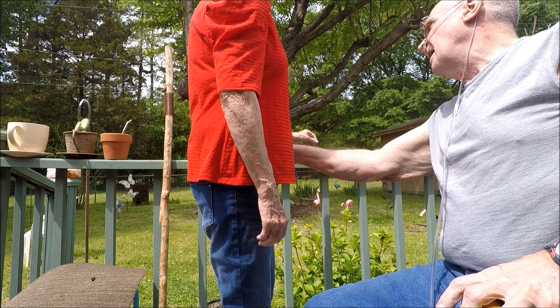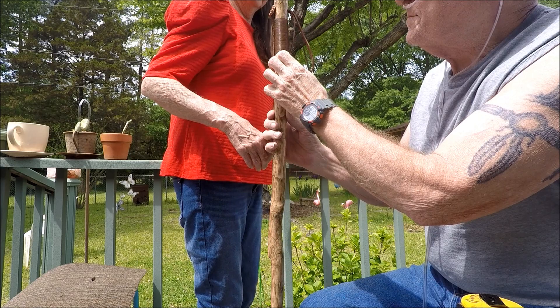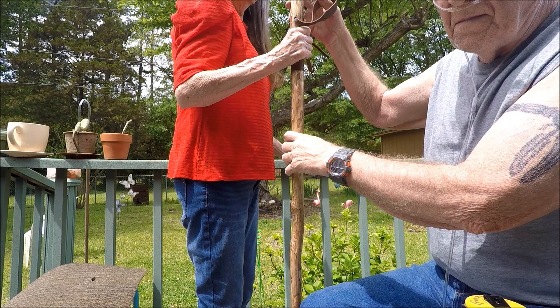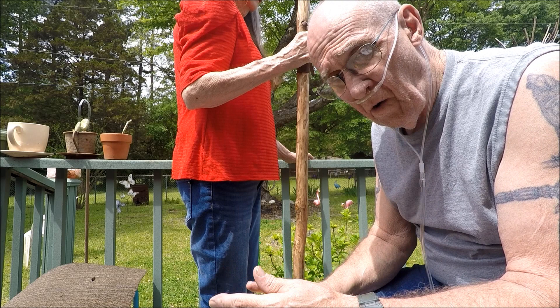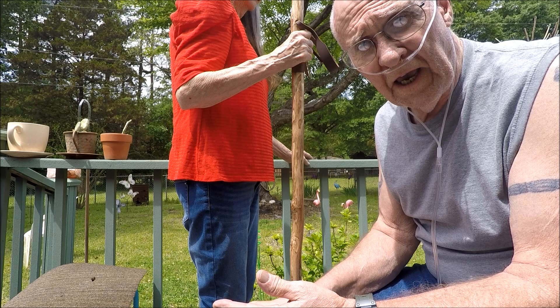For a walking stick, go ahead and grab it. Remember — you want to be in the shoes you normally wear for your cane or walking stick. You don't want to stand here barefooted, measure, and then put on a pair of hiking boots. You've got to wear what you're going to use your walking stick or cane with.